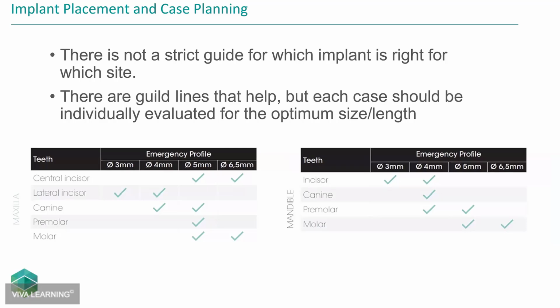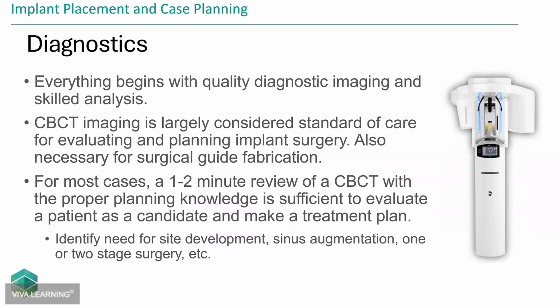And there are not any real strict guidelines for where to place what implant. That was something I always wanted to know when I was first starting placing these: well, what do I use? What's the minimum? Can I do this implant in this placement? That's a hard thing to kind of navigate from. And it does come down to getting the experience, and putting the biggest implant you can in that place without compromising your restoration is almost the real rule.